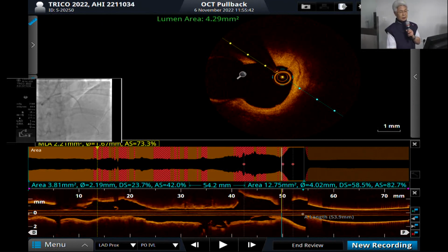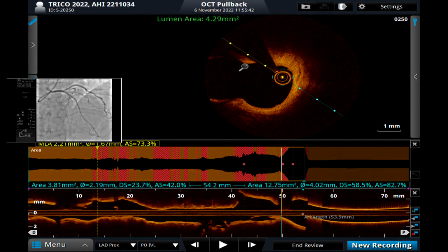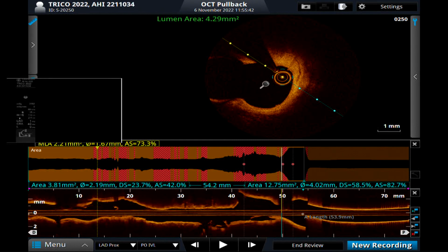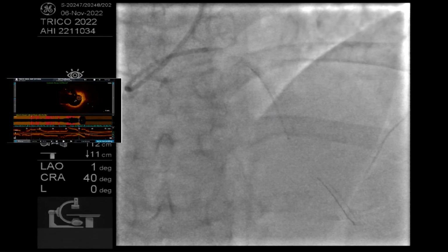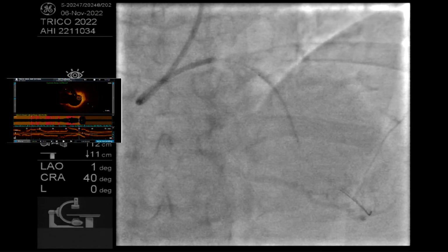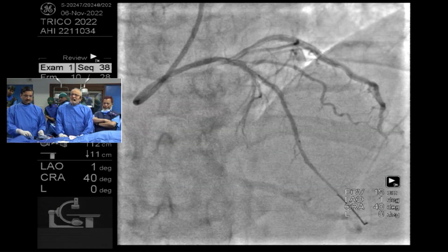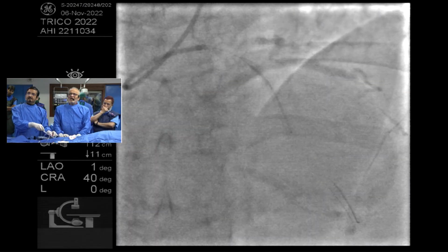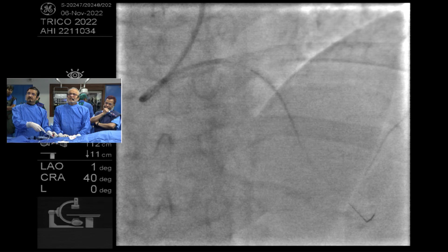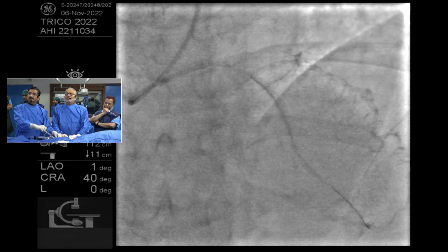See the way the stent went in. So I think we have done good calcium management here. Should I pull it back? Yes, a little back. Yeah, I think you come back about 2-3 millimeters at least. Just see now. Maybe still even more back. Yes, yeah. This looks good. Just check it. Looks okay. Or a little back. A little maybe back. 1 or 2 millimeters. Yeah, there is a plaque there. Yes, 2 millimeters back, right there. Just see now. Fine. This looks good. I think maybe that's good. Go. Yeah.